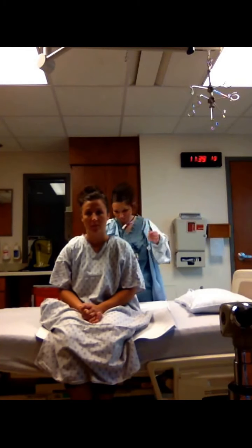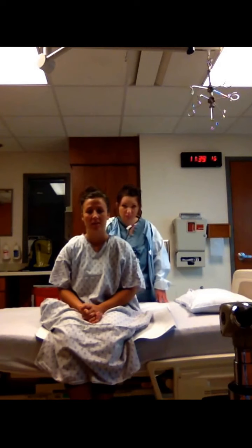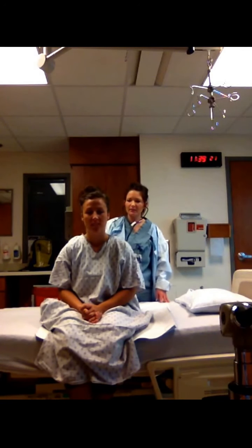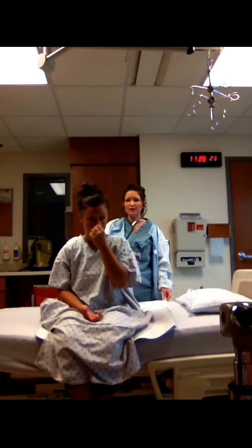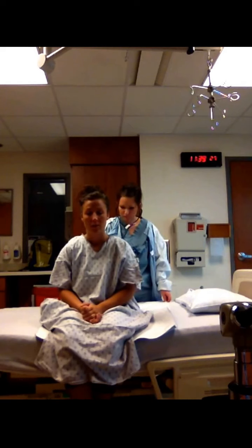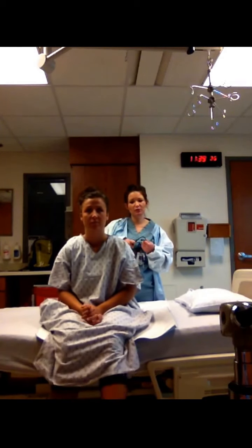Now, Courtney, every time I lay my stethoscope down, I want you to say E. Okay. E. E. E. Okay, Courtney, now every time I lay my stethoscope down, I want you to whisper 1, 2, 3, okay? 1, 2, 3. 1, 2, 3. Okay, and that is also very faint and muffled, which is a normal finding.